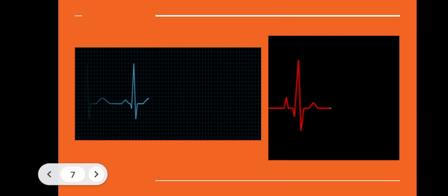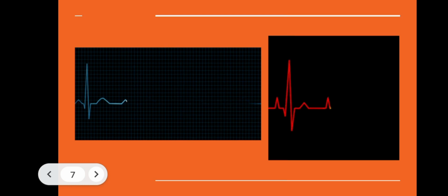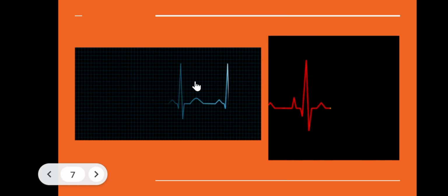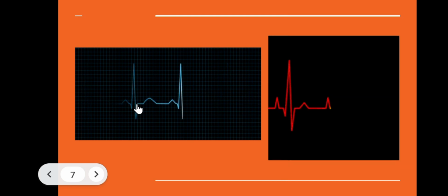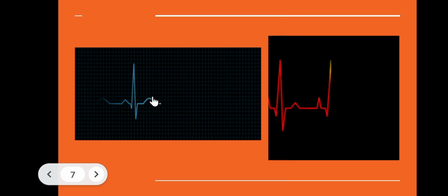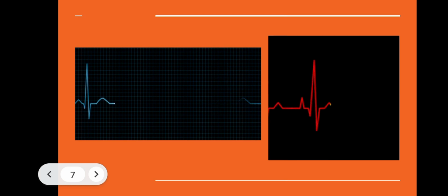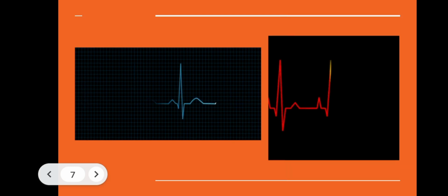Be mindful that a normal EKG shows a steady, regular heartbeat, with all the waves, as we mentioned a while back, and intervals appearing in the right order: your P, PR, QRS, ST, and sometimes U, intervals appearing in the right order, shape, and timing. Please don't forget our normal duration so we could figure out if an ECG is out of normal.